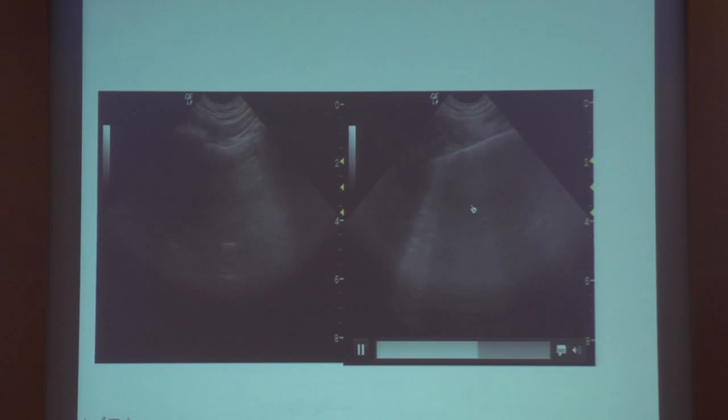Now, what does that indicate? This indicates interstitial lung fluid. If you see this in your patient, there is only one reason why it happens to be there. That's because there is interstitial and intraalveolar fluid in your patient. If you see it bilaterally, extensively, it indicates pulmonary edema. The pulmonary edema may be of cardiac origin, or it may be of non-cardiac, as in acute respiratory distress syndrome.